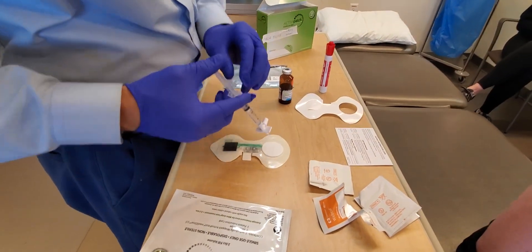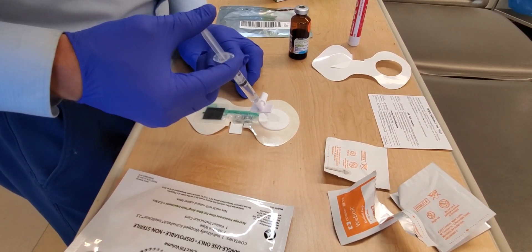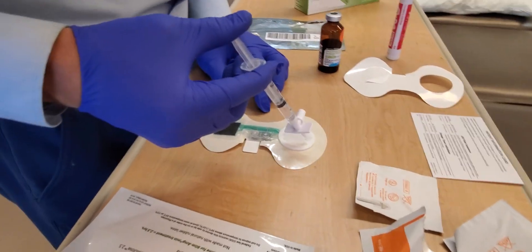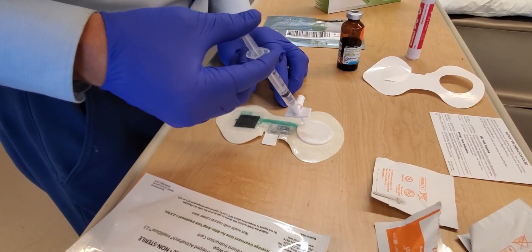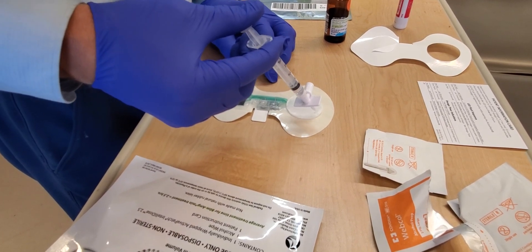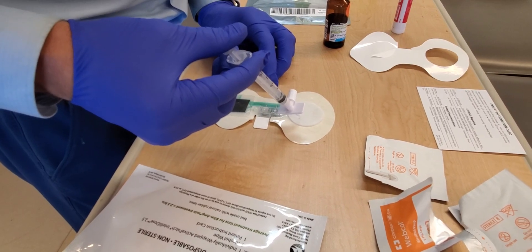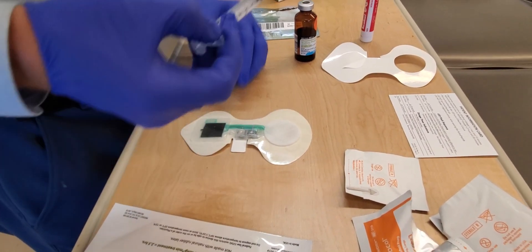Without overflowing the pad, we're going to start in the middle and gradually add some drops. I usually go in a concentric fashion so that it has even distribution throughout the pad. The patch will last up to four hours. When you put the patch on, you don't want to compress the pad — you want to compress the adhesive, because just like a sponge, if you squeeze it all the liquid flows out. You want uniform, comprehensive coverage of the entire pad.